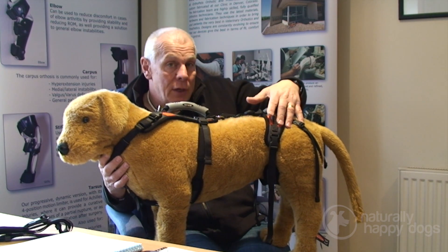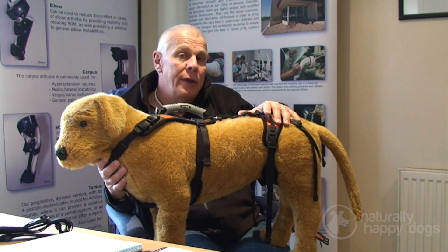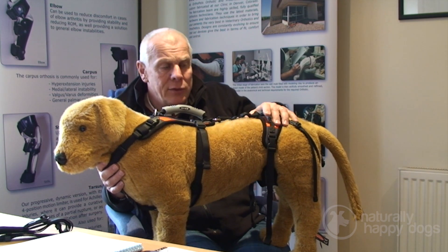The harness is used to help dogs that are recovering from surgery, dogs that have got partial paralysis, or even just older dogs that need a little bit of help getting up the stairs or getting up from the ground.